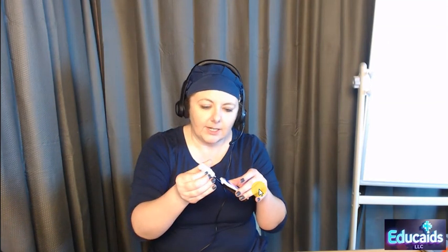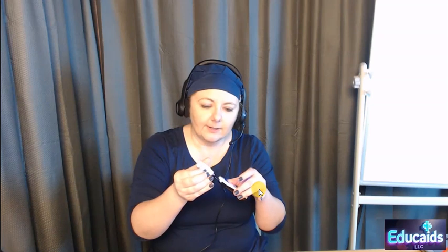Shut it back off and turn it back on. All right, so I've got this on. Here we go. And now it's ready for me to apply my sample, but instead of checking my blood sugar again, I am going to apply my control or my fake sugar. And we're just going to gently put a little bit on here. There we go.